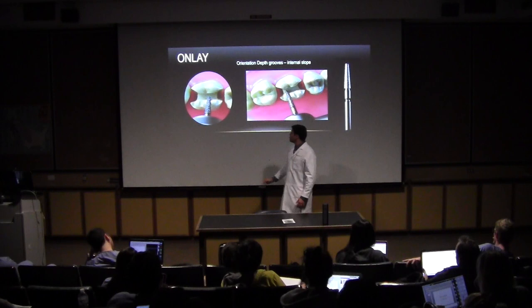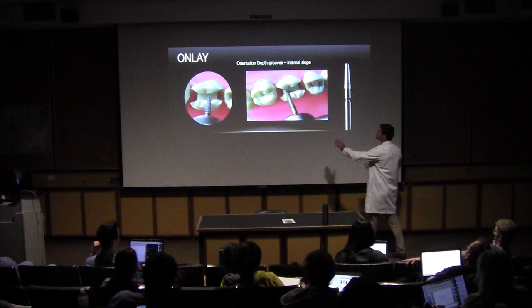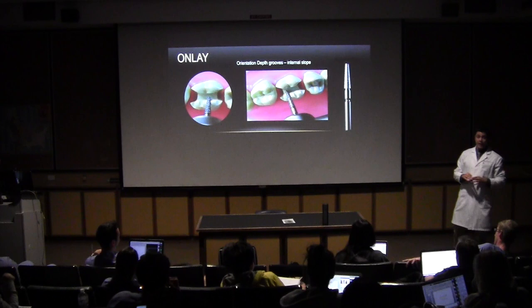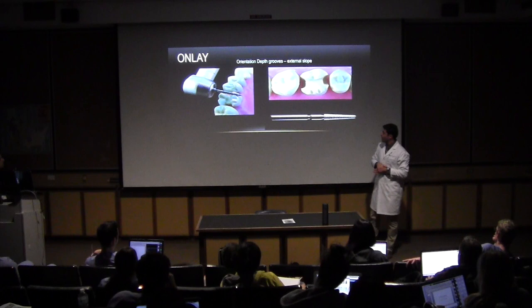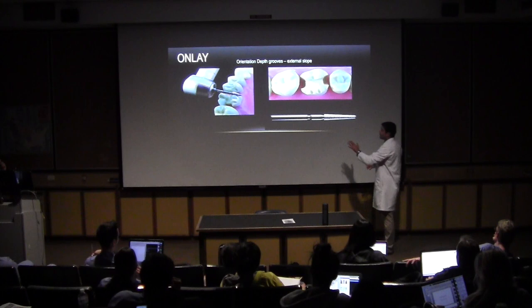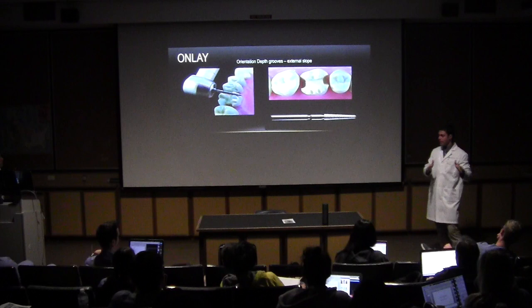So the first step now, after doing the inlay prep, is to do the orientation depth grooves on the internal slope of the cusps. You can do 3 or 4 of the orientation depth grooves. And then we connect all these orientation depth grooves, okay? Making a flat surface on the internal slope of the cusp. After that, we're going to do the same thing on the external slope. Do 3 to 4 orientation depth grooves, and then you connect all these grooves, shaving down the cusp. And we are going to have 2 flat surfaces, an internal slope and an external slope.